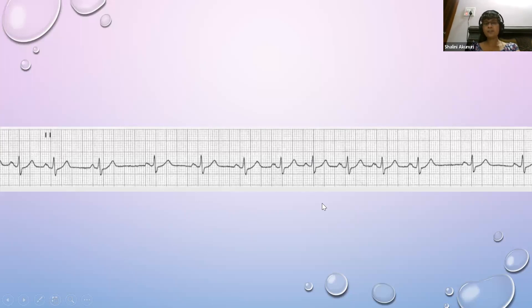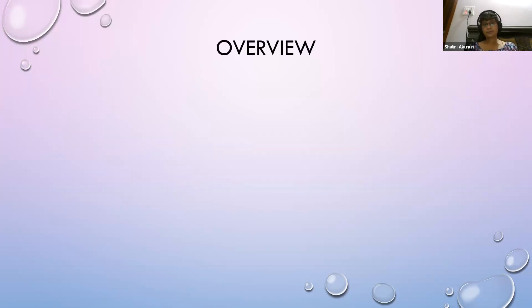This is an example of sinus arrhythmia. This is not a true arrhythmia - this variation is seen because of variation in respiration, inspiration and expiration. So sinus arrhythmia is quite normal.